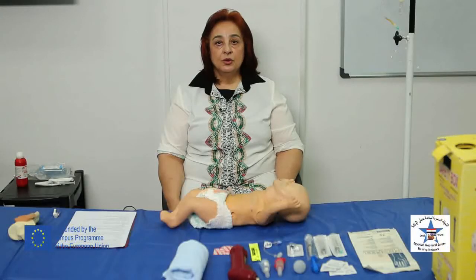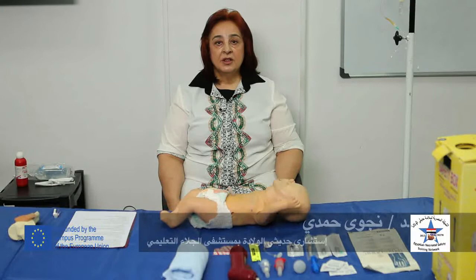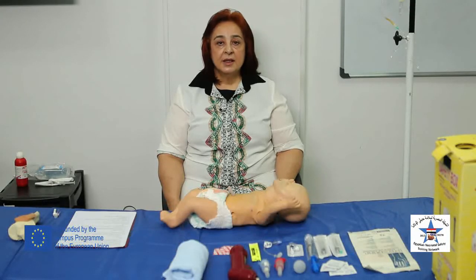Today we are going to demonstrate intraosseous access in neonates. Intraosseous access is a life-saving procedure which is carried out in neonates in emergency conditions where vascular access, whether peripheral or central, is not feasible or difficult.